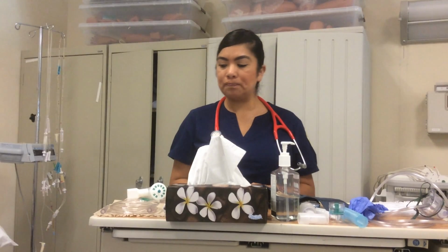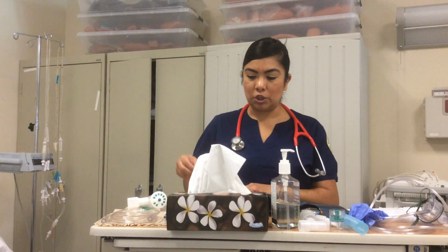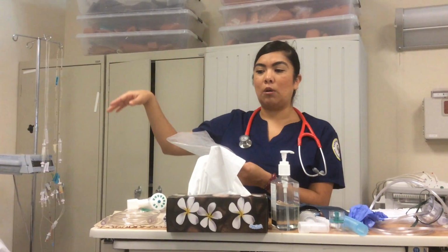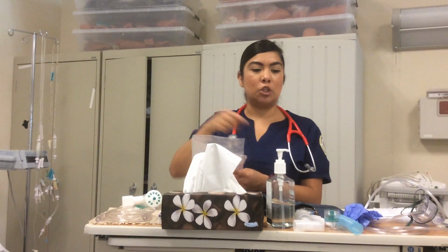So before I go into the room, I'm going to gather my material, okay? What I have here is a bag first off that I'm going to leave with the patient on the back of their headrest. That way, in case they need a treatment later on throughout the day, we could just put the used equipment back into their bag, and we're going to put their name. That way they could continue to use the same one, okay?